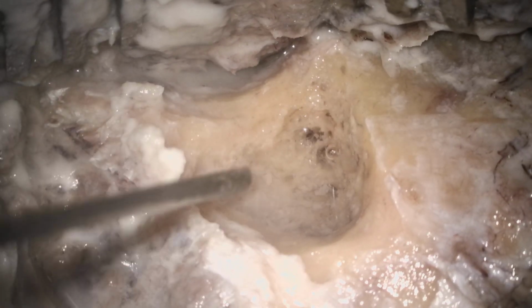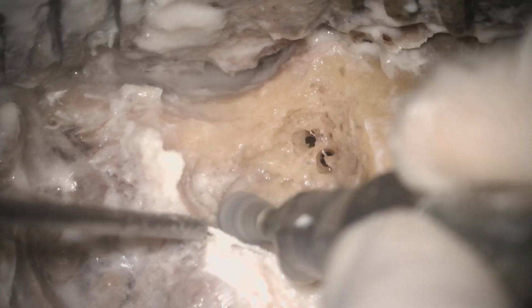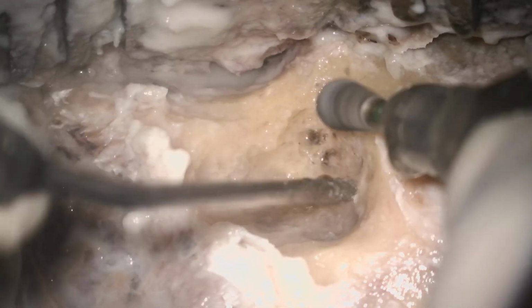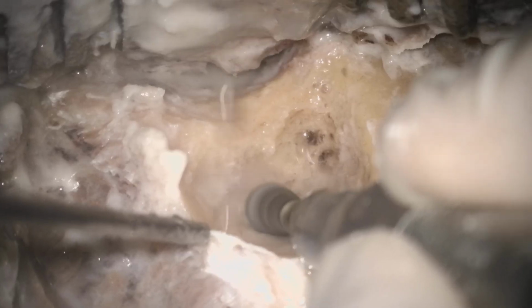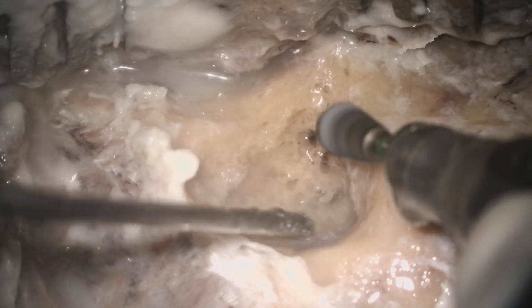But whenever you enter into the medial part of the dissection, the blockage will be very less, because there will be very small bone chips and bone dust. So in the first part, go very slowly and cautiously, do not damage any important landmark.